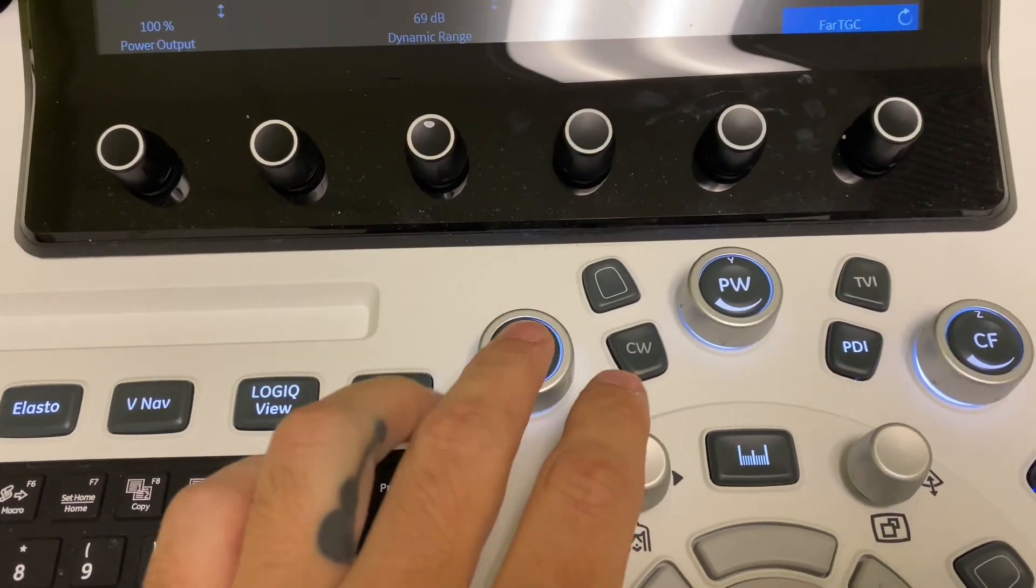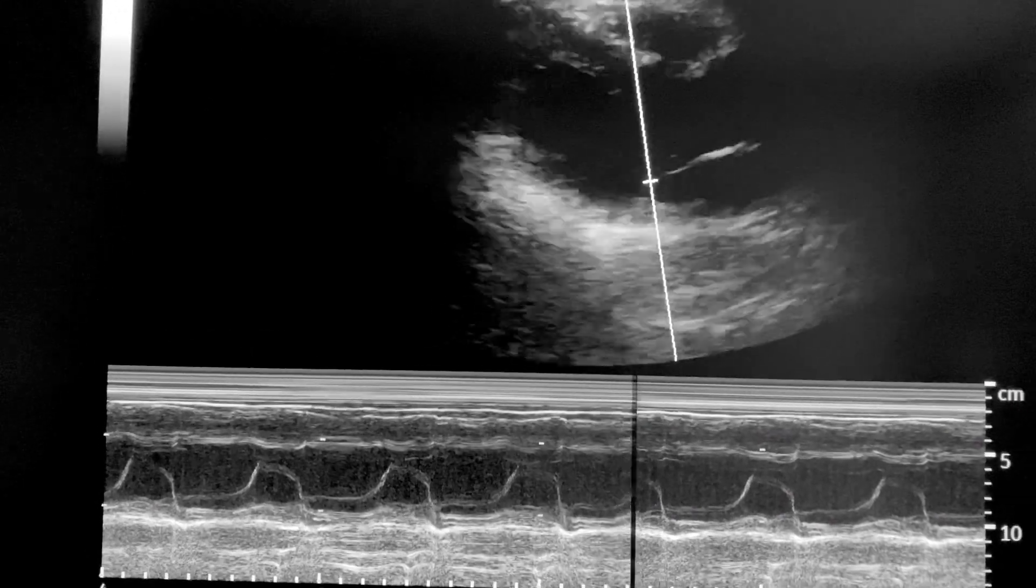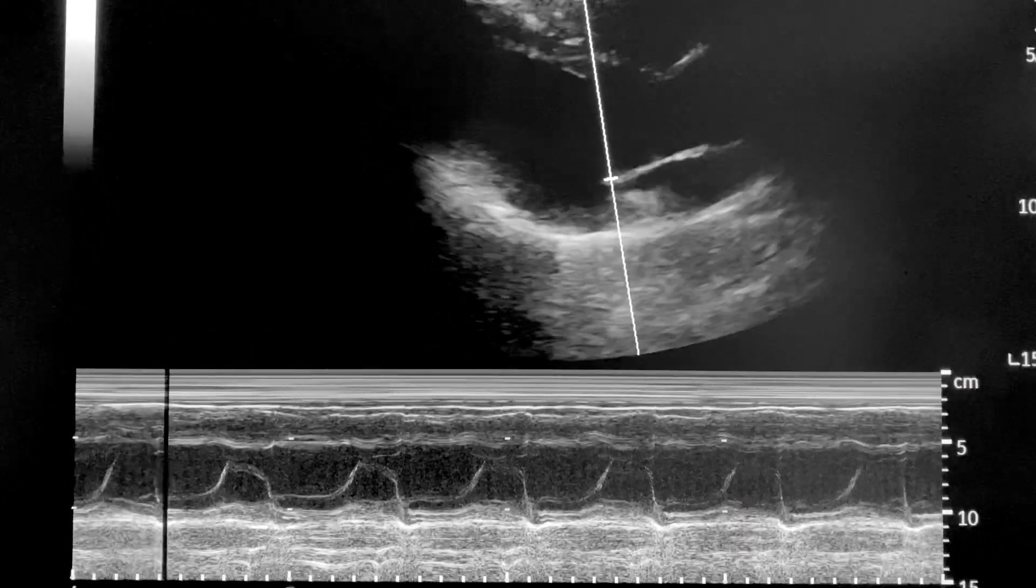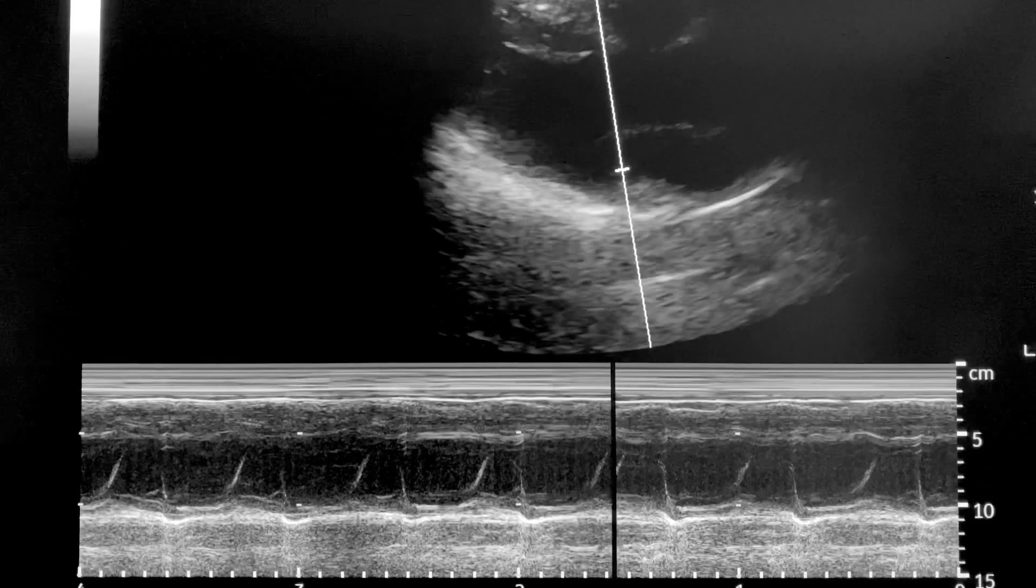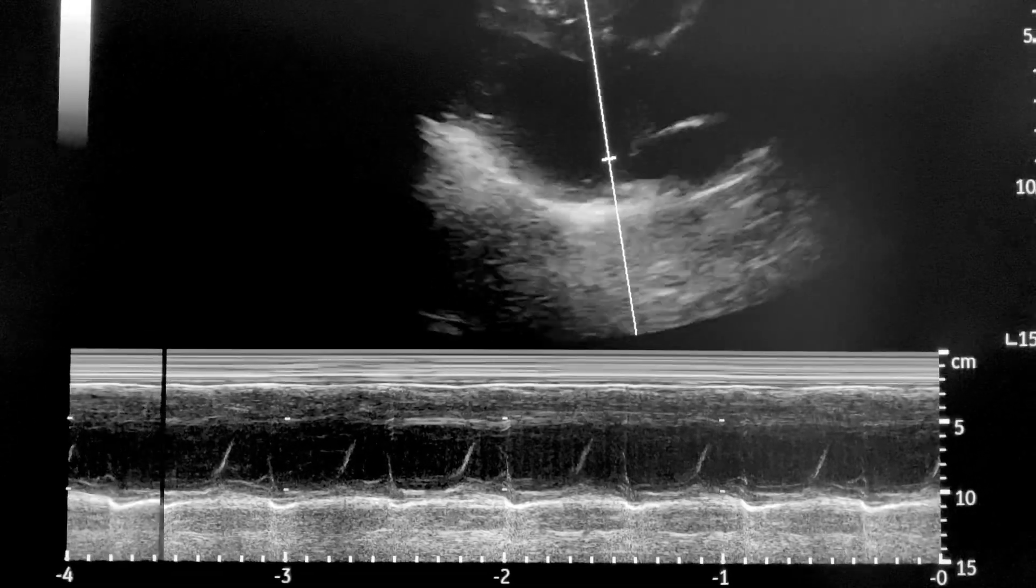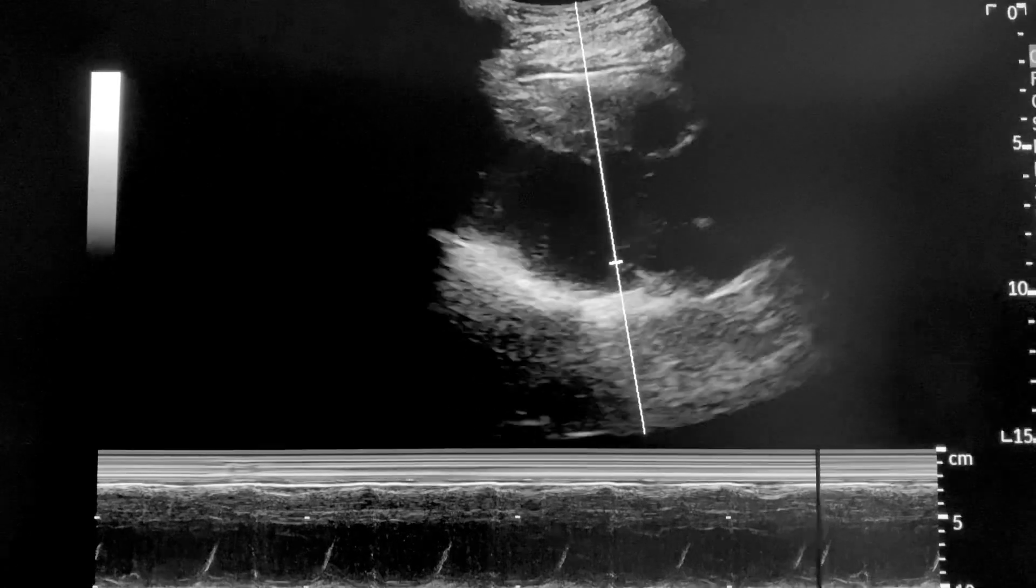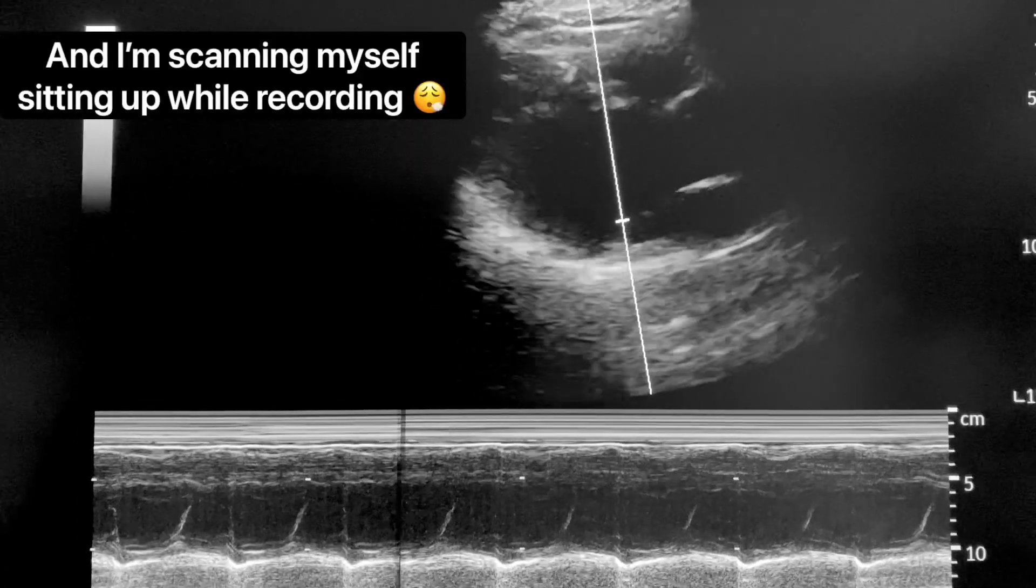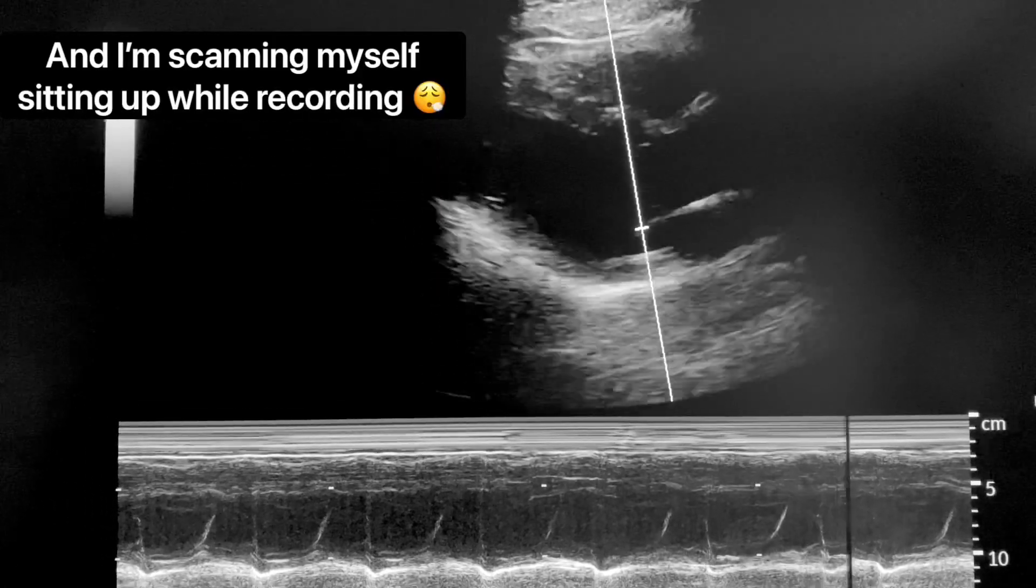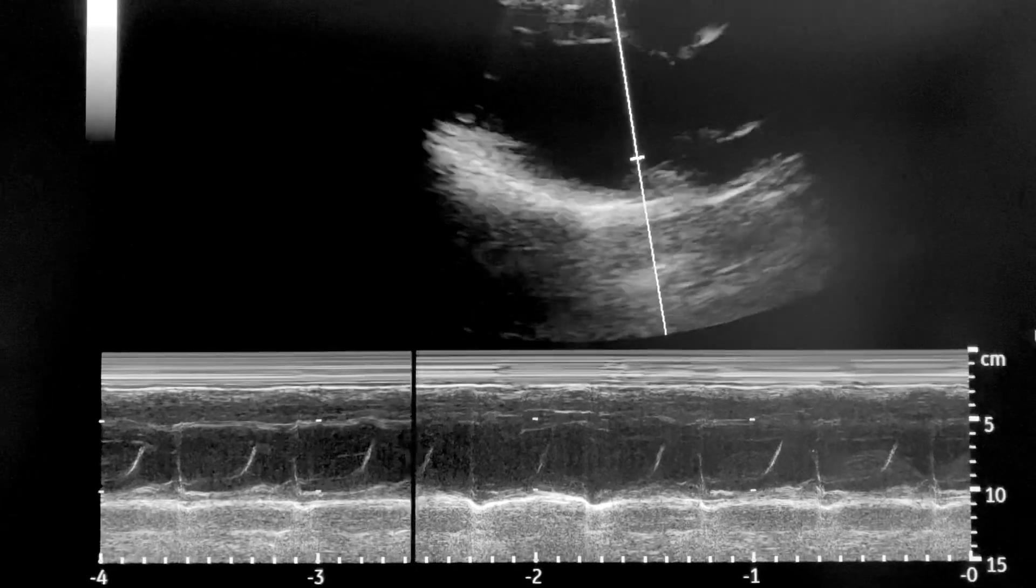So that's Logic View for you. Then you have M-mode, which you can use for motion, any motion of anything really, but you can use it a lot in cardiac applications, fetal heart rate. We use it also for diaphragm movement. Here's an example of my left parasternal long axis-ish view, and there you can see the M-mode at the level of the mitral valve. So this is obviously not very optimal. This is with the curve probe. We don't even have cardiac presets on this machine, but just so you can get an idea.